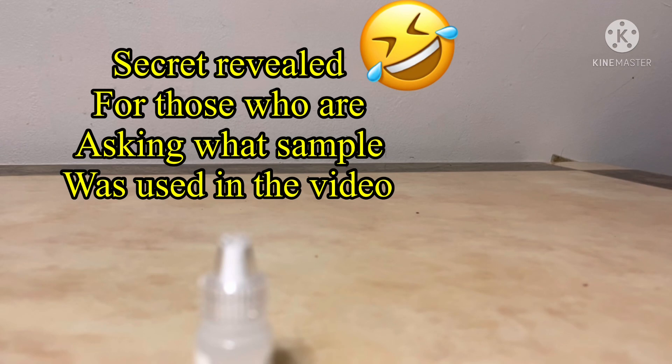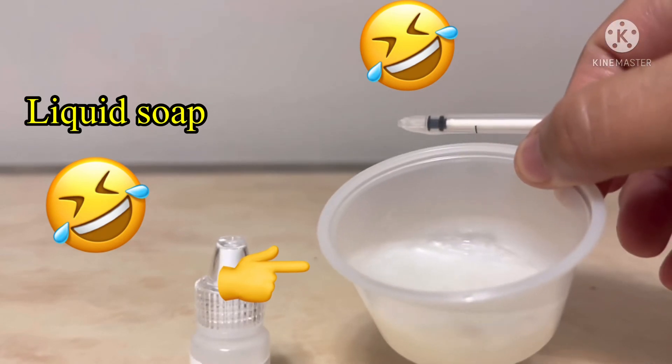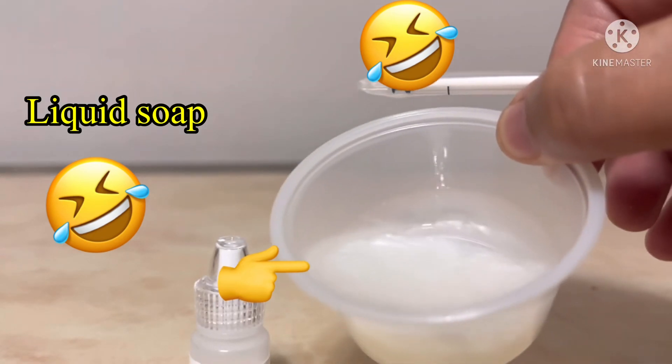For now, I'll use something like a sample substitute, which is soap.